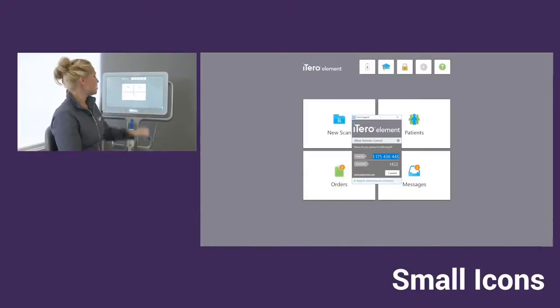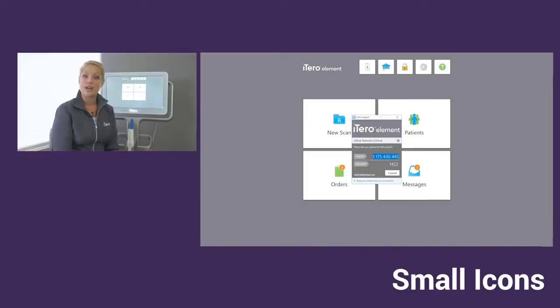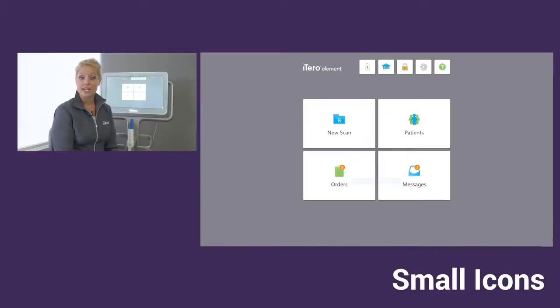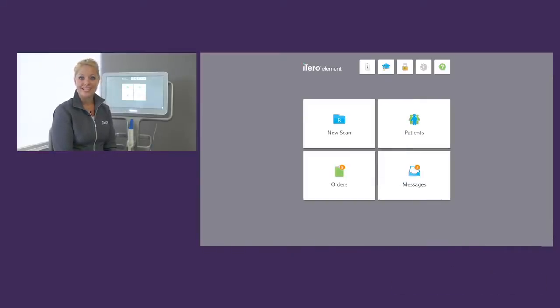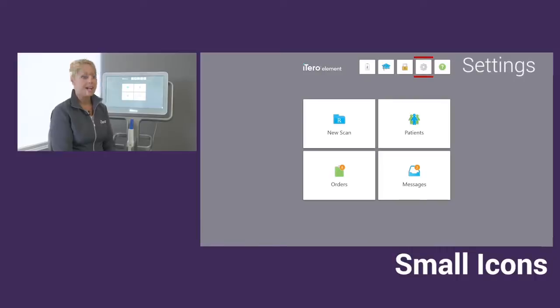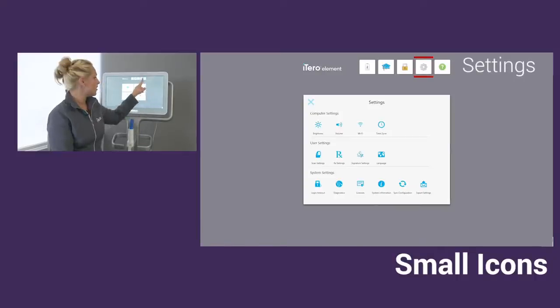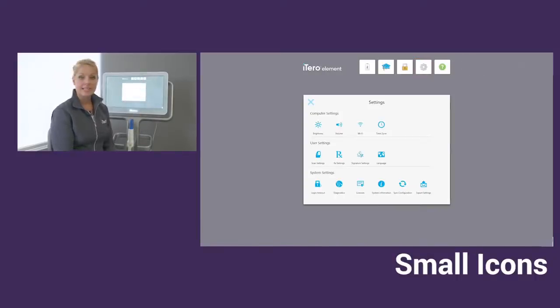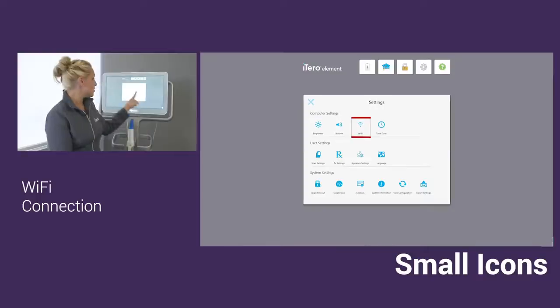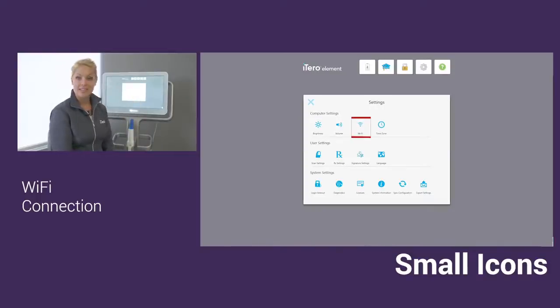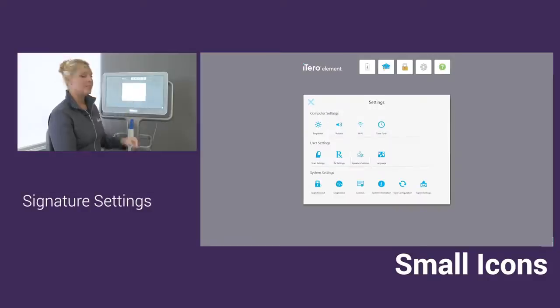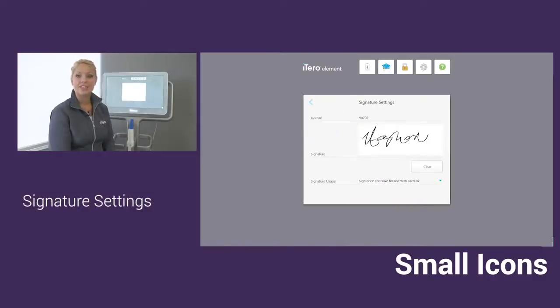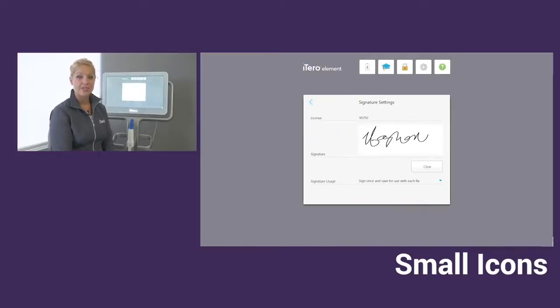We also have the option of setting your preferences for your scanner in the settings icon, which is the gear. In the settings icon, you can always go to the wifi and check the status of your connection. In addition to that, we have our signature settings. Just make sure that the doctor has their signature and license number in this area.